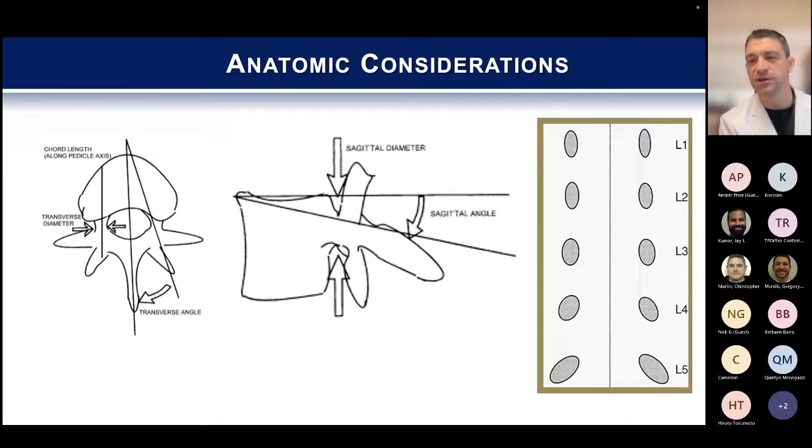A couple other things, just like pedicle shape. The shapes do change as you go from the low lumbar spine to the upper lumbar spine. I mean, you'll see this a lot. So I always encourage you guys, whenever you're having a case where you're doing pedicle screw instrumentation, to look at the CT scans, that can actually be really helpful, and you'll assess these patterns even while you're looking at it, and you'll see the shape of the pedicles actually change based off of their anatomic location, becoming very vertical in nature up at L1 and oblique down towards the low lumbar spine.